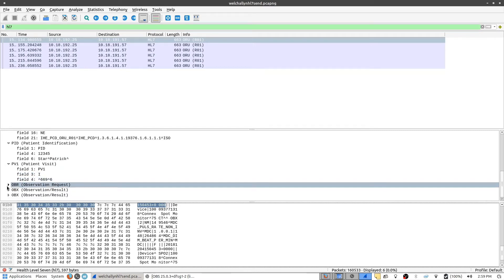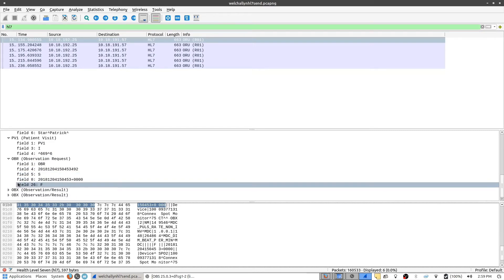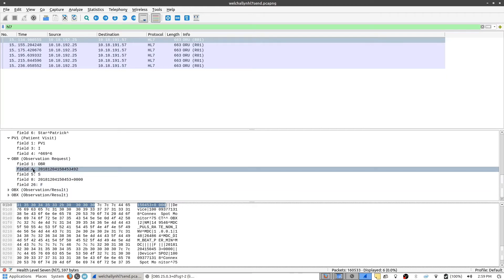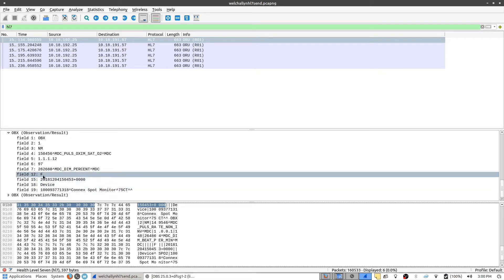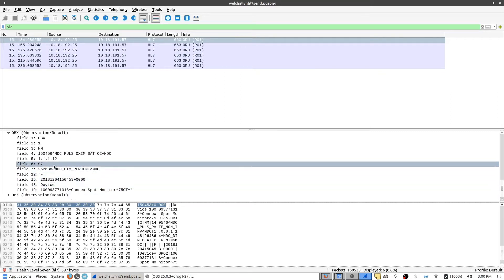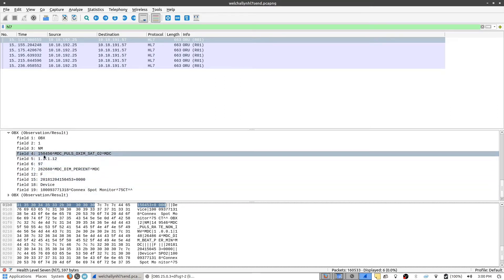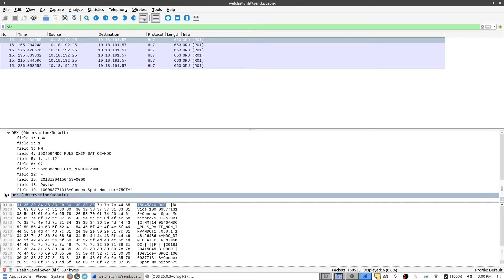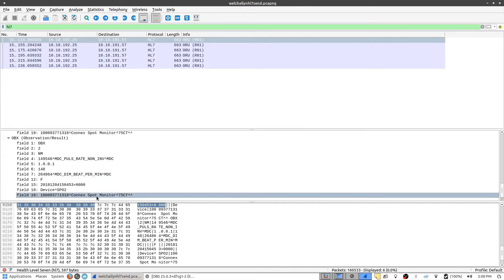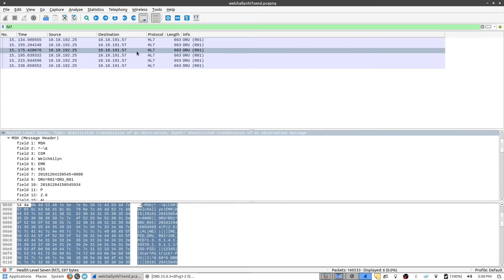As we keep opening these up, we can see other information such as the time, the date and time that the measurements were captured. We have things like the pulse symmetry, which was 97%. You can keep going through these packets and see the individual packets for themselves.